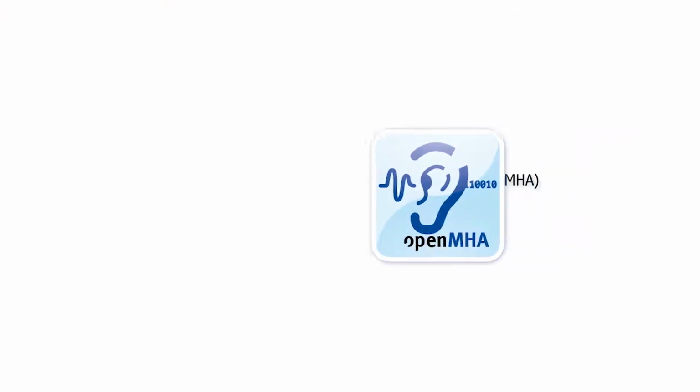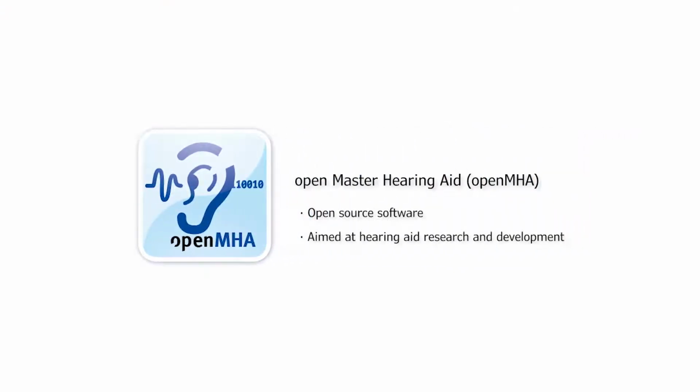First, let's talk about the openMHA hearing aid. openMHA is an open-source software tool that is tailored to the development and the evaluation of hearing aid algorithms. It has the capabilities that are required for real hearing aid processing, real-time low-latency multi-channel audio signal processing.